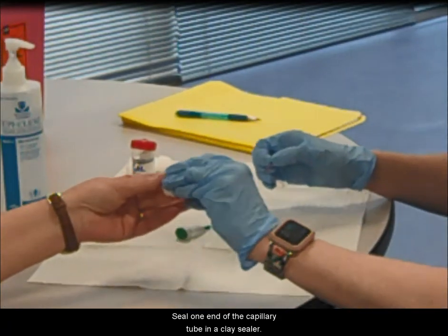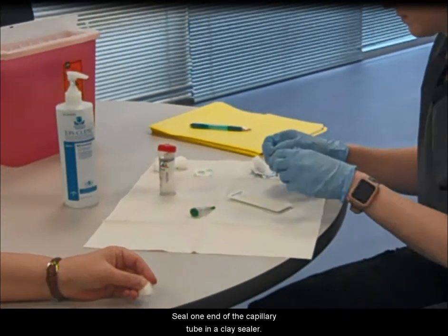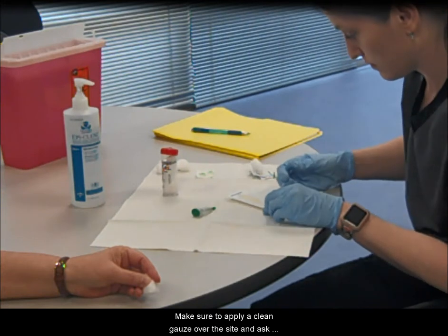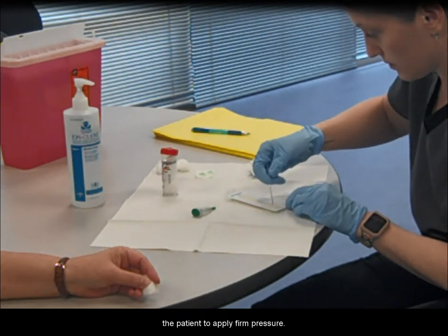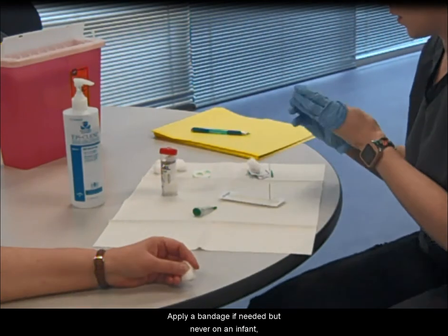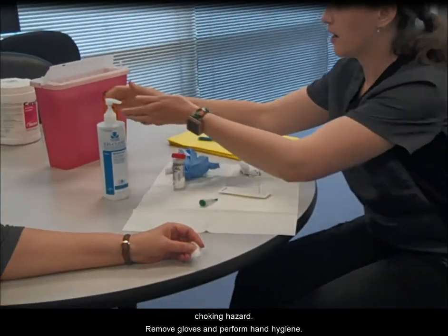Seal one end of the capillary tube in a clay sealer. Apply a clean gauze over the site and ask the patient to apply firm pressure. Assess the patient and the site. Apply a bandage if needed, but never on an infant due to choking hazard.